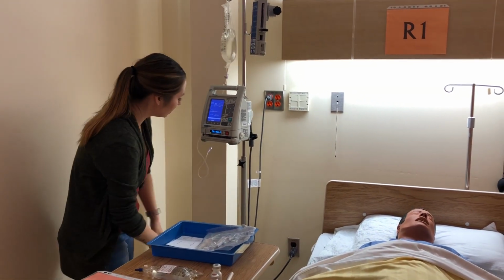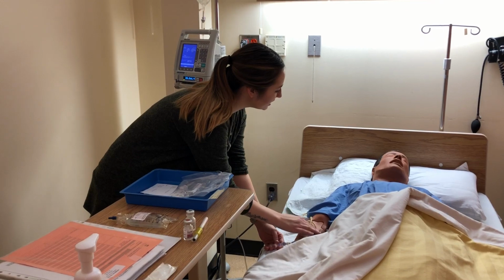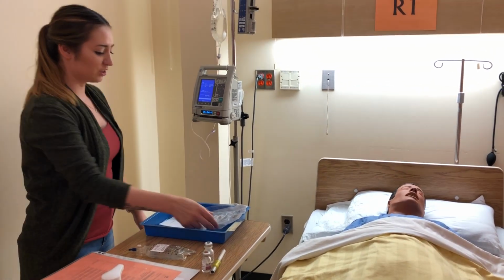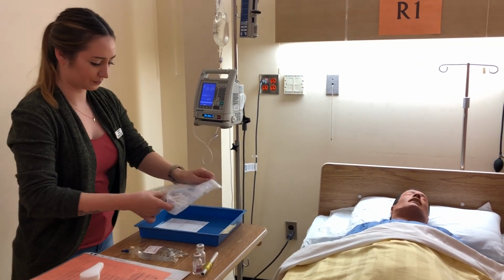It's infusing at 30 milliliters per hour. It seems to be infusing fine. And I'm just going to palpate around. Do you have any pain or tenderness when I do this? Nope. Okay, so I am not concerned with how it's infusing. So now I will set up my secondary line.